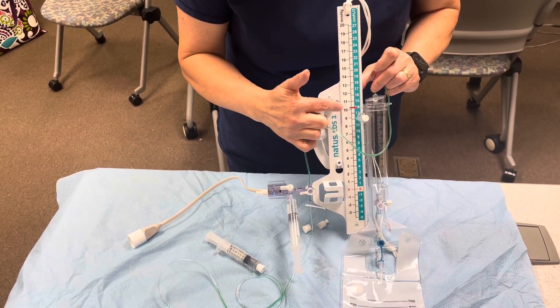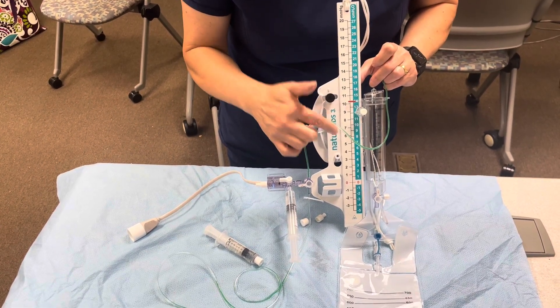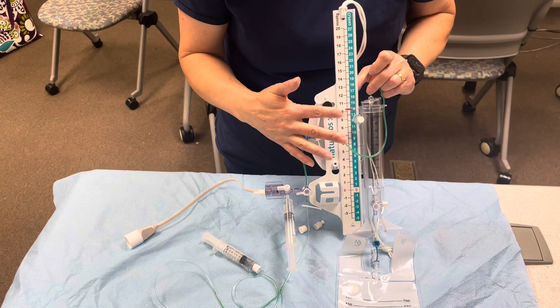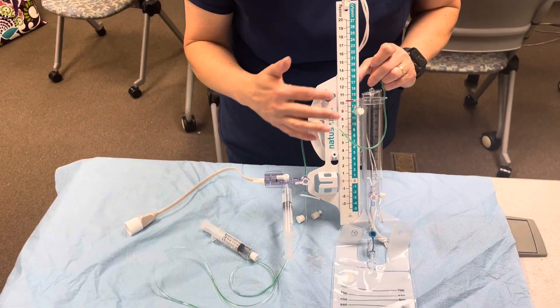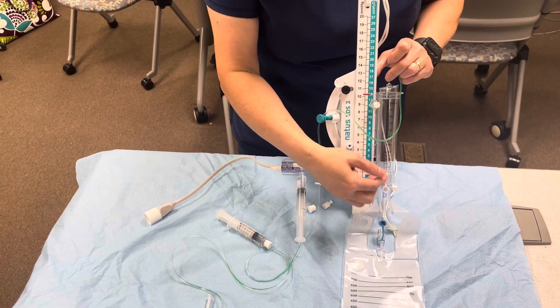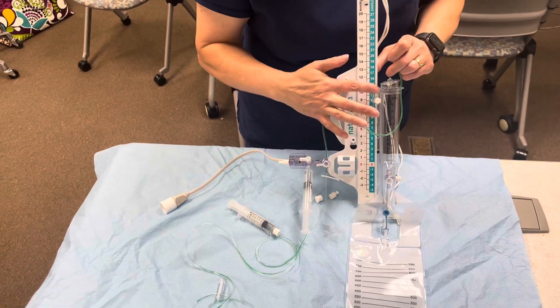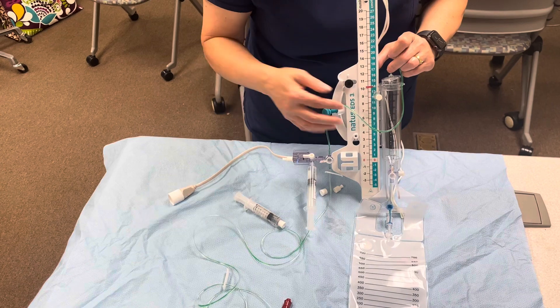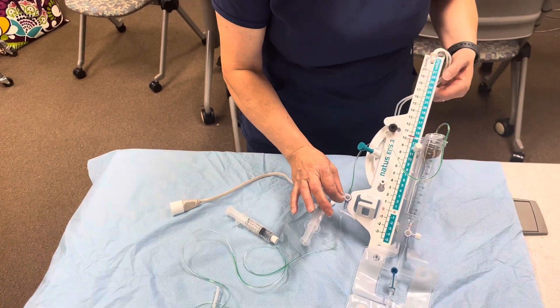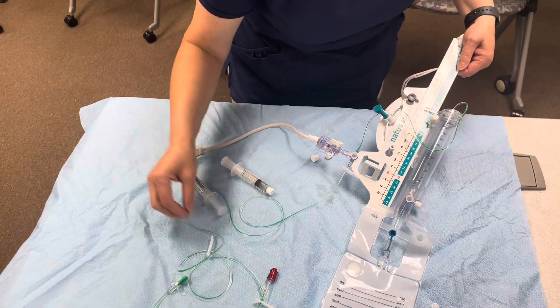Normal ICP is five to fifteen millimeters of mercury. If we have increased ICP, blood, or excess CSF, we want to make sure we're draining any excess. It could be fifteen, or we could start with ten — so anything over ten we're going to have drainage and monitor it on an hourly basis, emptying it from the drain into the bag. Confirm the level with the neurosurgeon.